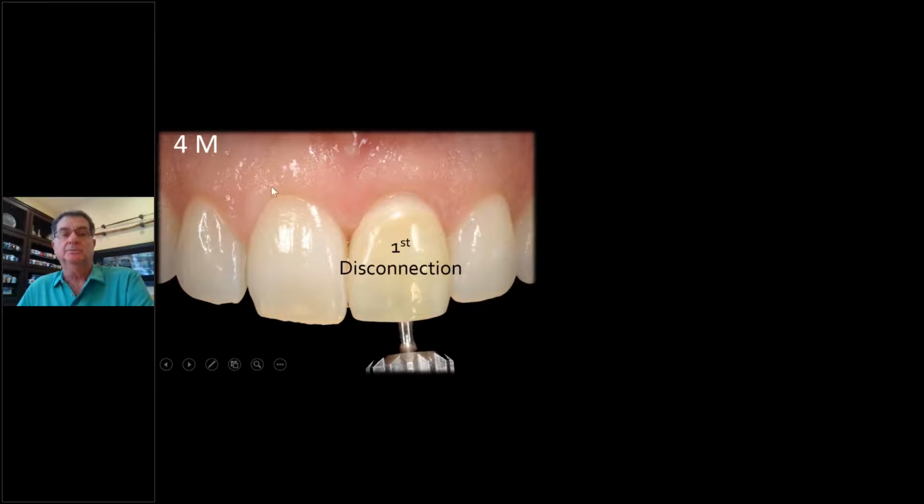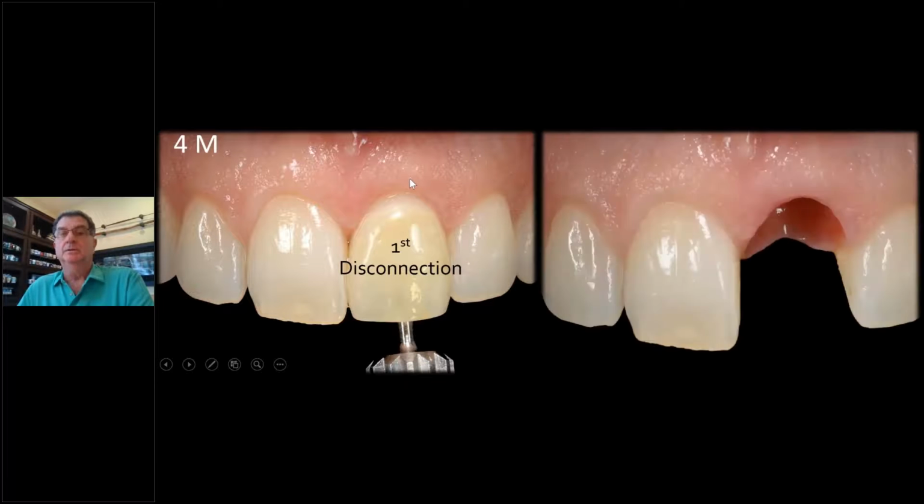Here is at 4 months. Notice we hardly lose anything. It looks beautiful. That's what we like to see. That's because we went palatally, and there's plenty of thickness of tissue and bone now on the buccal. Similar to what Abdul said about narrow diameter implants, it gives you more room on the buccal. Palatal placement is number one, along with the narrower diameter with good stability.